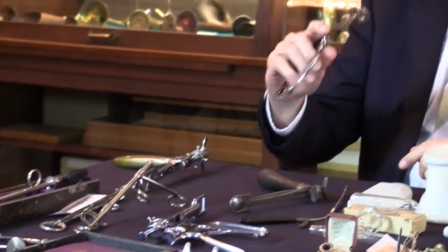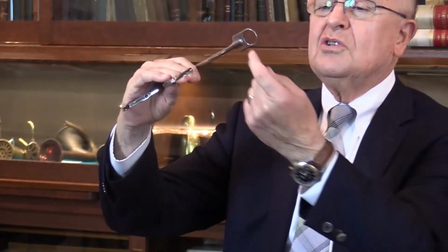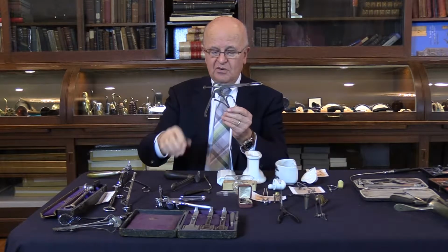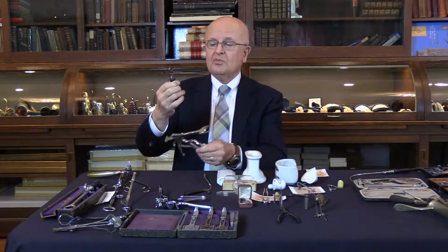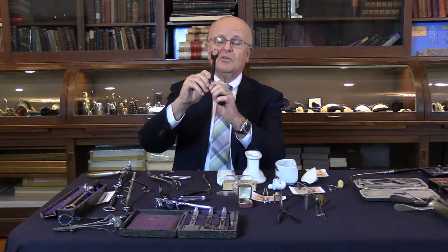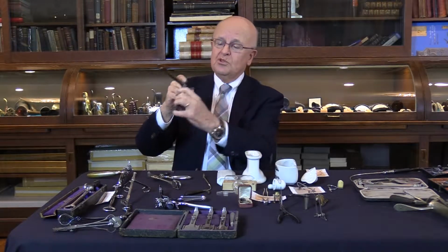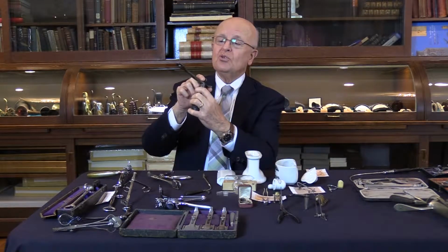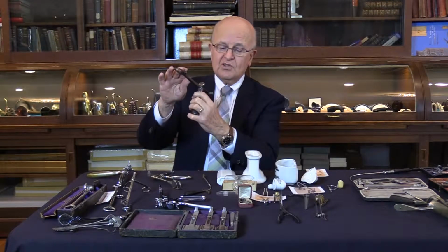So the principle of the guillotine is to introduce the tonsil through this hole, and then the knife here will advance slowly and cut off the tonsil. This came in different shapes and different designs. This is an older piece. This is an ebony handle, and it's the same principle. You just push it here instead of the handle that I showed you earlier, and that's how the tonsils used to be removed.